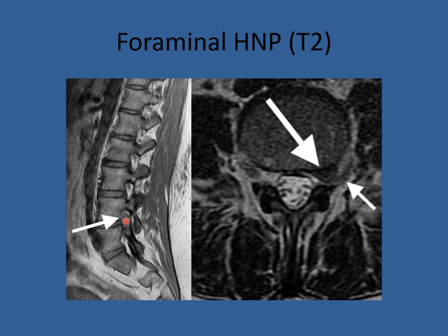Here is another foraminal disc herniation: normal above, normal below, and a space-occupying lesion in the foramen. The typical sign on the right shows the nerve root free and surrounded by fat. On the left, the nerve root is compressed by a disc herniation. We know this is a T2 image because water is white and fat is white.